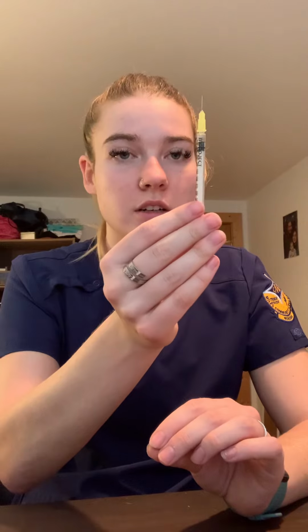and then we're going to tap out any air bubbles and eject them. And we're going to double check our dose. So we have a 0.1 ml. We're going to cap it with our one-handed technique and scoop it.